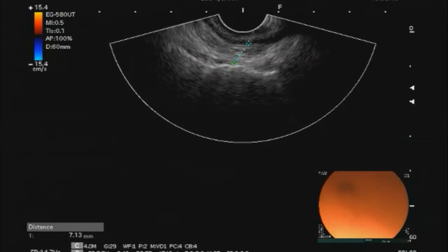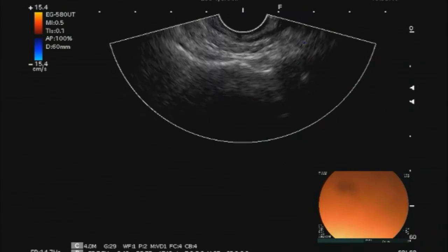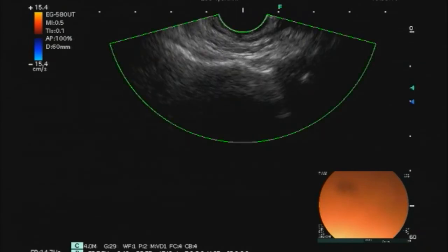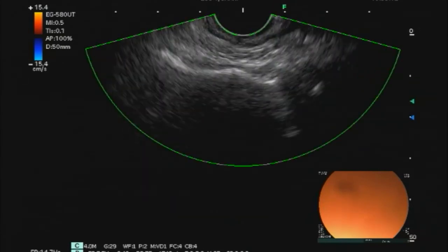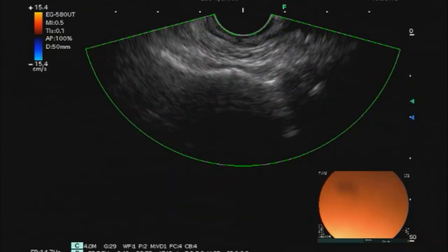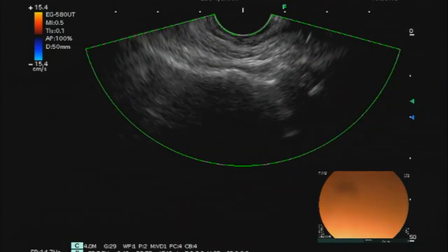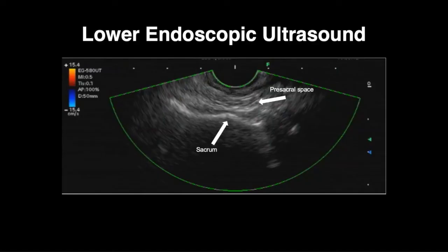The distance between the EUS probe and sacrum is measured, with the distance to the target area being less than one centimeter. Careful attention is made to evaluate for intervening structures posterior to the rectum and anterior to the coccyx. Color Doppler is used to evaluate for vasculature within or near the pre-sacral space, as the presence of large vessels may prompt consideration for an alternative approach.